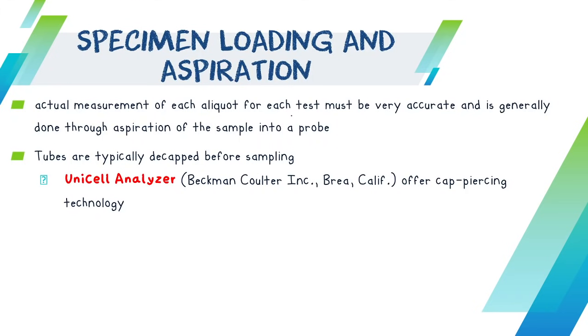Labi na katong mga Sysmex and Pentra na brand sa machines na ako nagamit, na encounter, ang style ana is we do not have to remove the cap, just place it automatically in your racks. Isulod lang po dayon sa inyong machine and then wala na, siya na bahala i-pierce ana, siya piercing technology na siya na magkuha og blood.